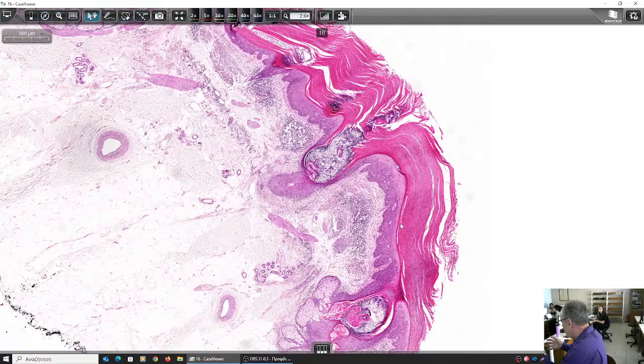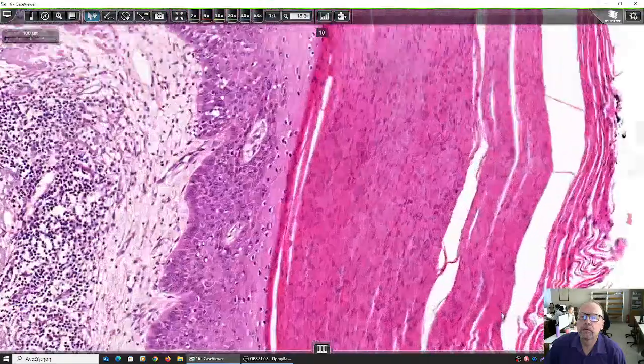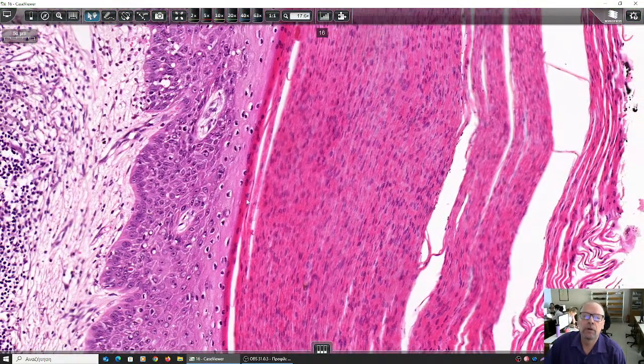Its thickness is more than all the other layers. It is so hyperplastic, I'd say, that its thickness exceeds the thickness of all other epidermal layers. Which one is this? Tell me. Want to show you in higher magnification? Here it is. This one. Look how thick it is. And it has this nature you see here. Which is this layer?